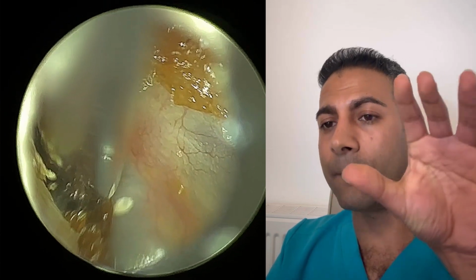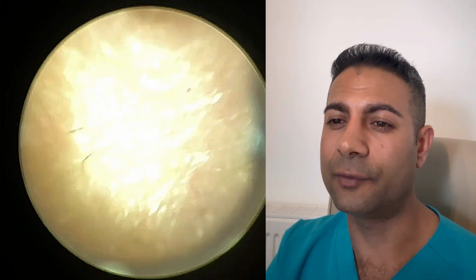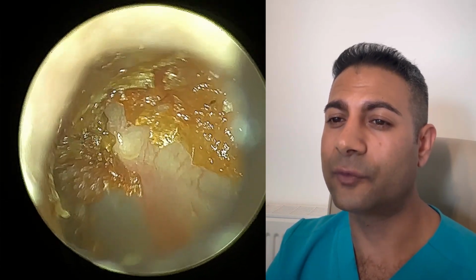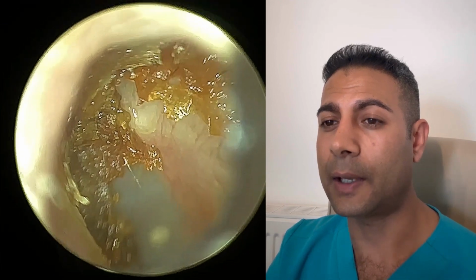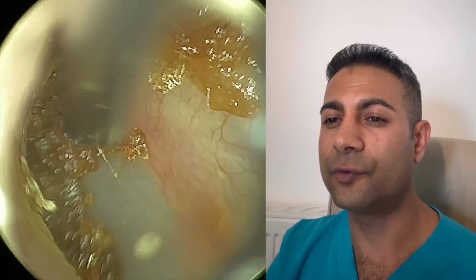So I'm just manipulating the speculum in the ear. So I'm angling my wrist so I can change the angle towards the anterior recess. I think now I'm just going to go to the back, peel away some of this keratin, and I'm going to go to the roof of the ear canal here and peel away some of the skin adhesions that's there. And again, the zoom feature really helped.